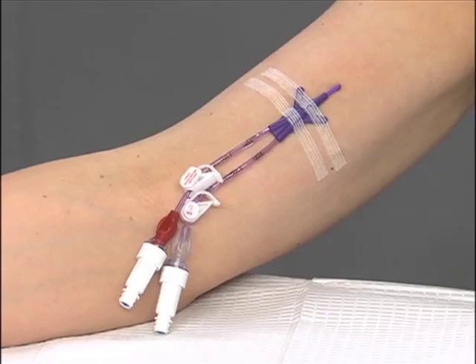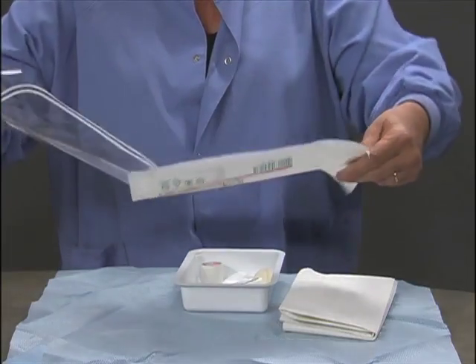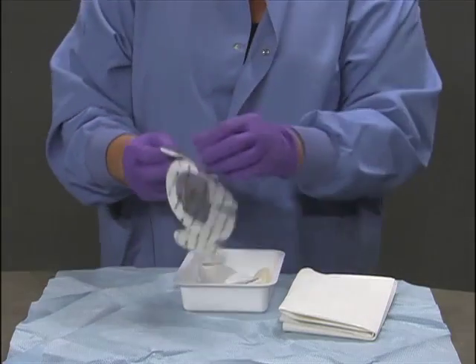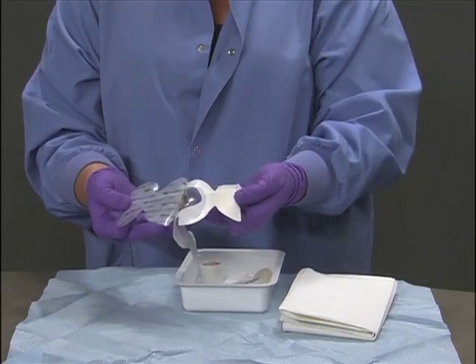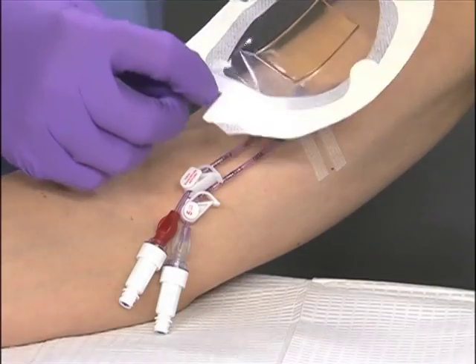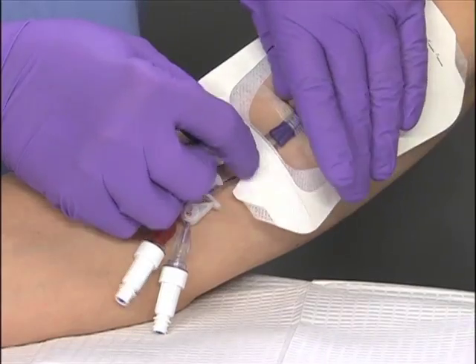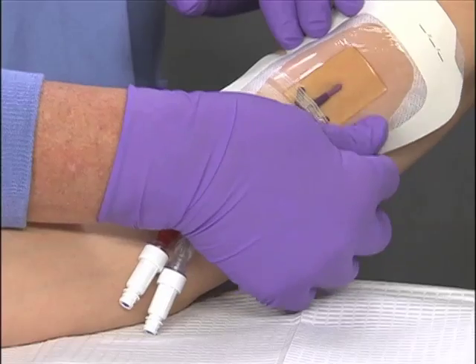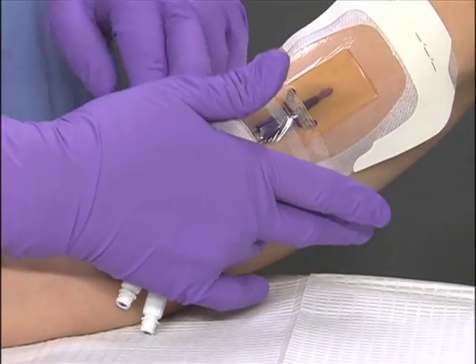To apply the Tegaderm CHG dressing, open the package and remove the sterile Tegaderm CHG dressing, placing it on your sterile field. Peel the liner from the dressing. Center the CHG gel pad over the catheter site and smooth down the dressing edge. Do not stretch the dressing while applying. Slowly remove the paper frame. Use firm pressure to enhance the dressing's adhesion.